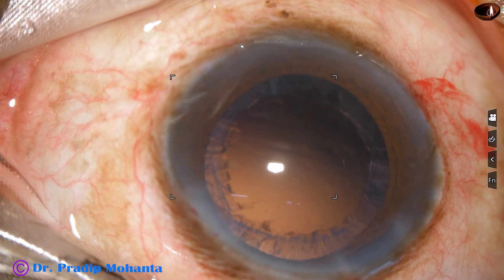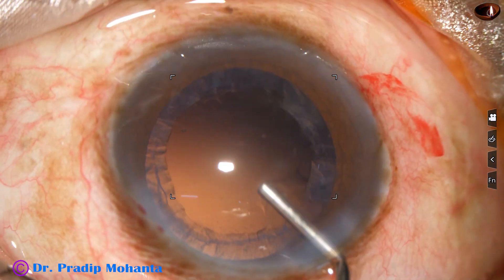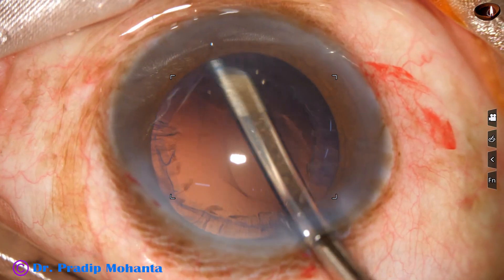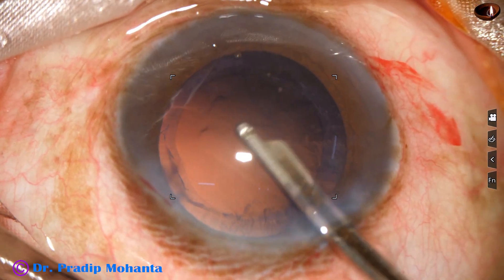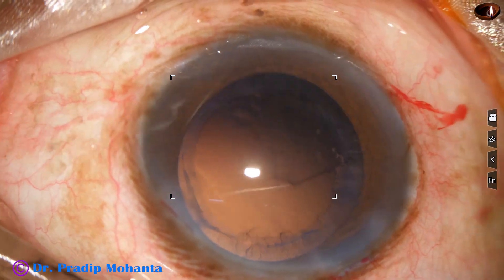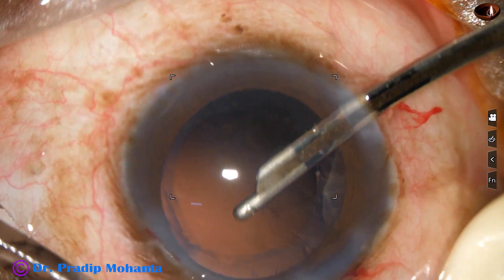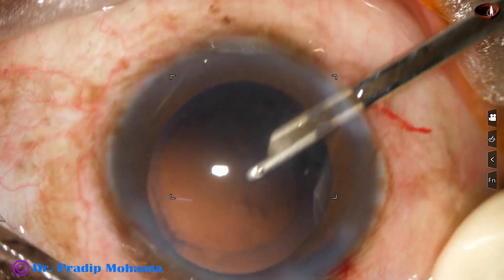The nucleus has been nicely managed. Now some viscoelastic is injected into the anterior chamber, and a 23-gauge Simcoe cannula is being used to remove the cortex. I find that the zonule is healthy and there is no sign of zonular dialysis at any place. All the cortex has been removed.